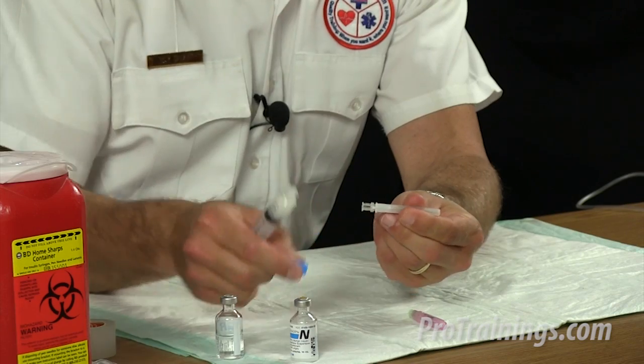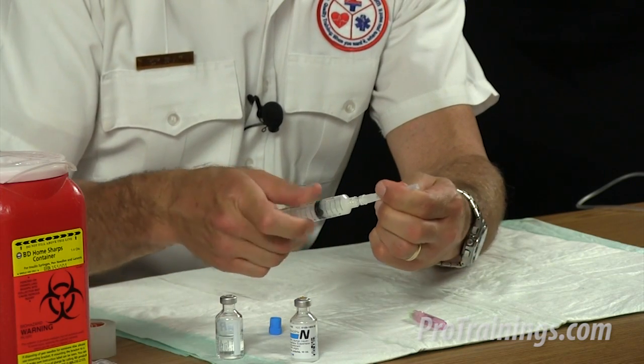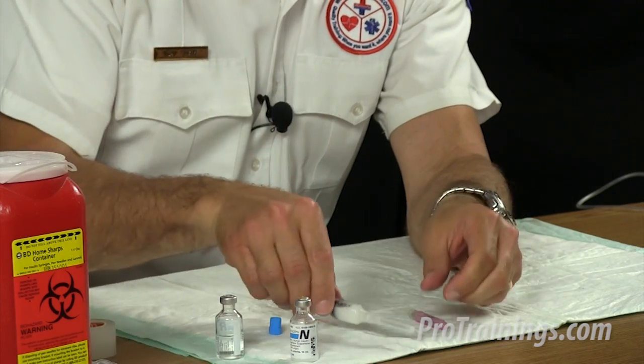And then use the new sterile needle on the actual syringe to deliver the medication. Remember, never re-enter a multi-dose vial with the same needle and syringe. Always use a new sterile needle and a new syringe.